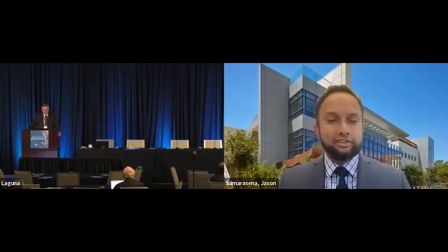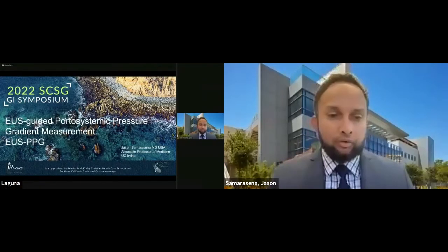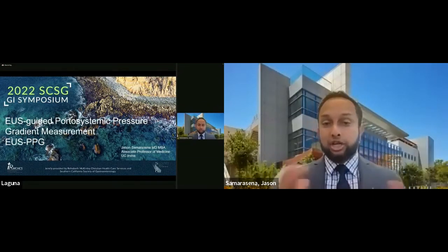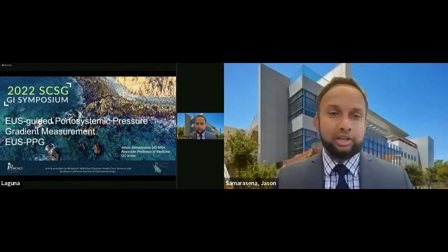My name is Jason Samarasena. I'm an interventional gastroenterologist at UC Irvine Health, and it's my pleasure to follow Dr. Chang and keep on the theme of endohepatology, really one of the, I think, most exciting areas in interventional GI and even hepatology. And I'm going to show you something that I think gives some credibility to that statement.